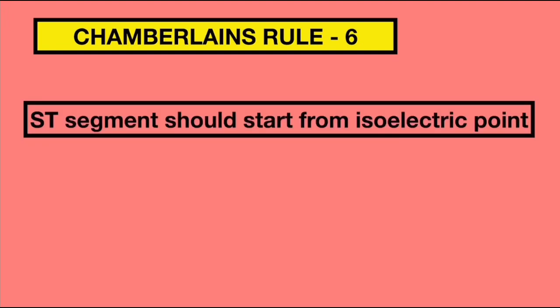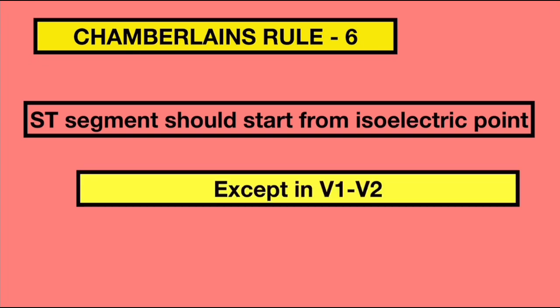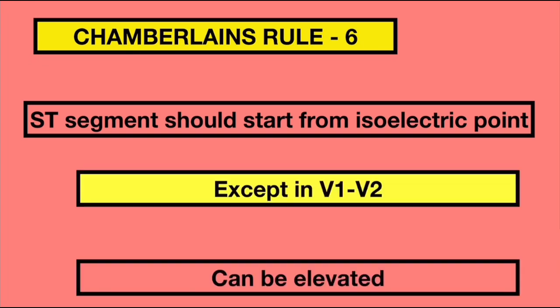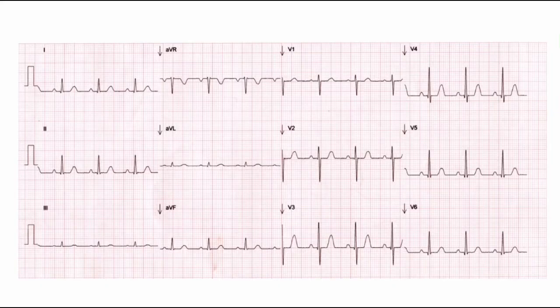Rule 6 states that except in lead V1 and lead V2, the ST segment should start from the isoelectric point. It can be a normal finding in V1 and V2 if it is elevated minimally. In this ECG, we can see that all ST segments started from an isoelectric point, even in V1 and V2.